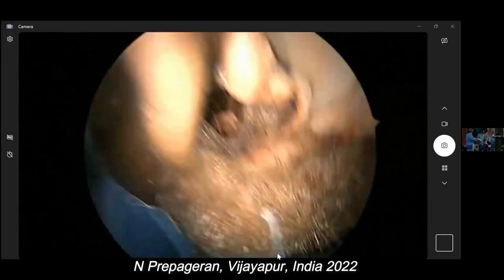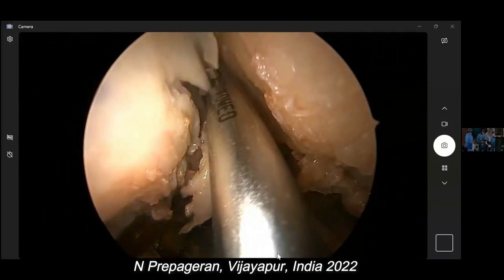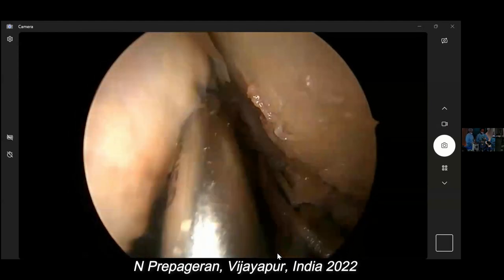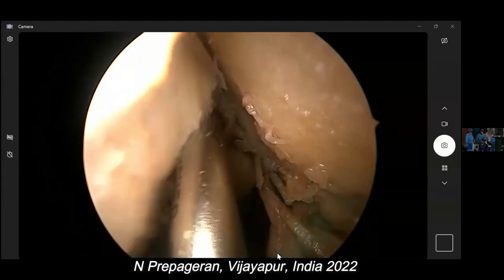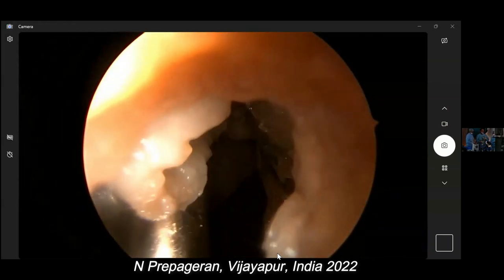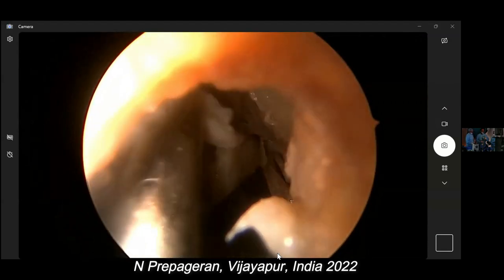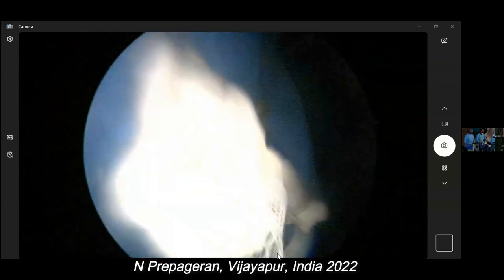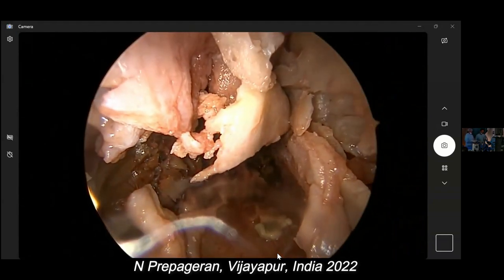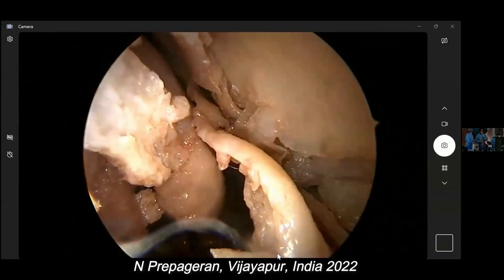I'm going to remove part of the septum, septal flap. Okay, this is the septum. The one that's already been used for the septal flap, this one, right? So I'm just going to remove all this so that it doesn't come in your way. Okay, after doing this, can we see this? What you want to do, this is the mucoperichondral flap.